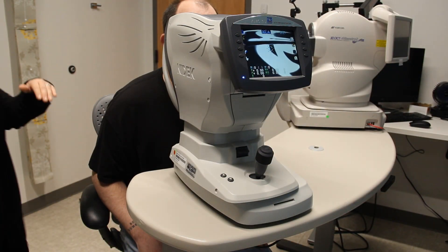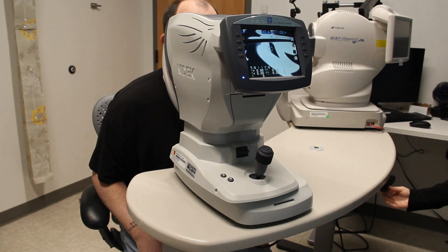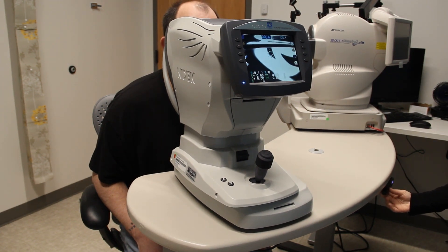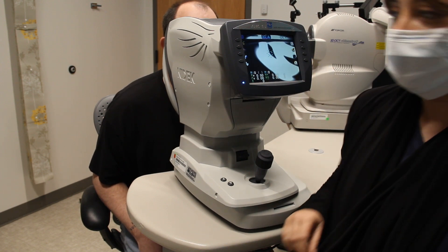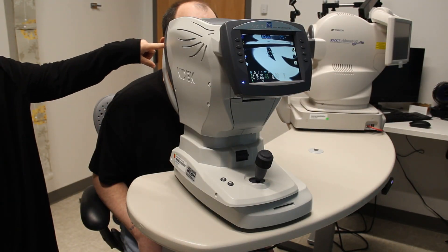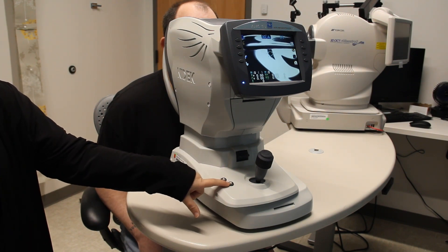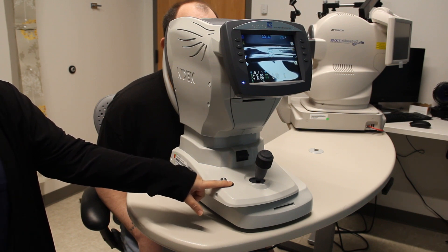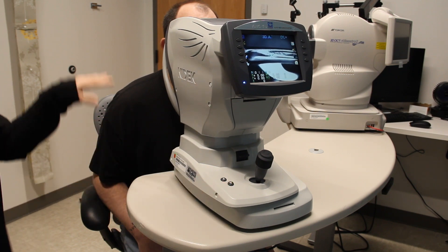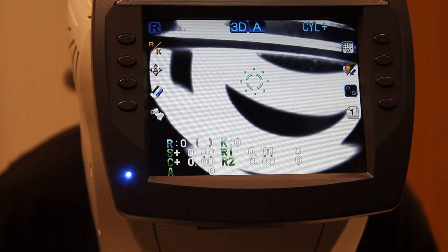Now check where they're lined up. If they look like they're stretching their neck, bring it down just a tiny bit. Make sure their eye is level with the eye mark. If you need to bring them down, just hit this button and it'll lower the chin rest. Now he looks nice and level with that eye mark.